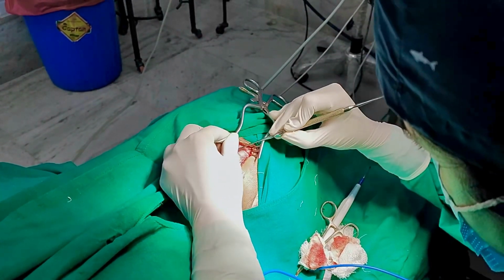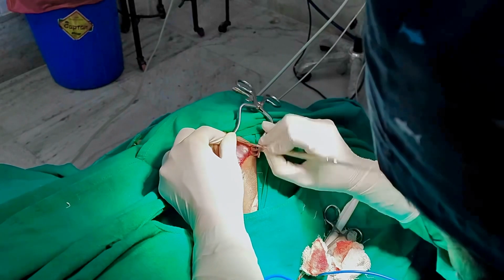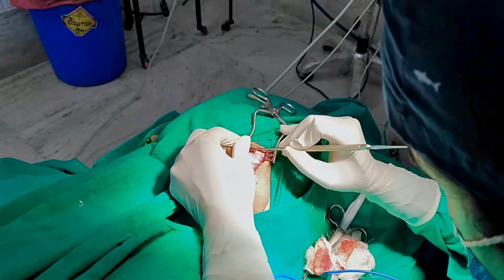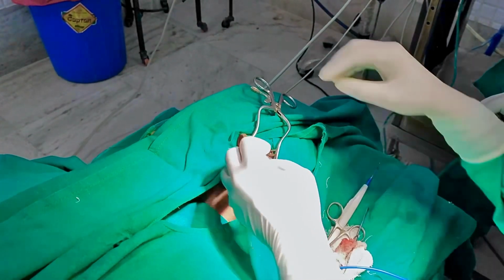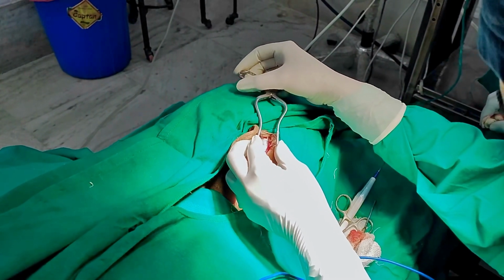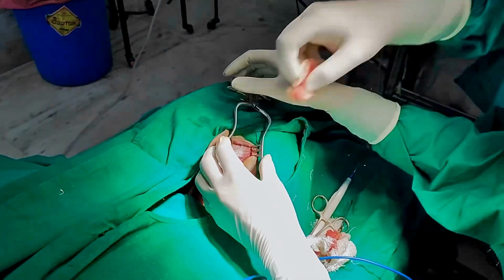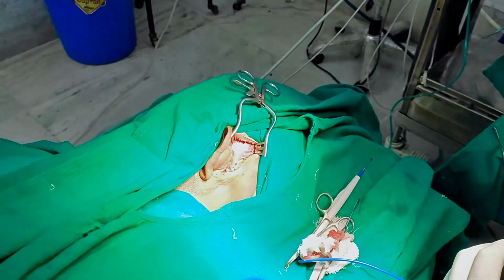So it is self-retaining, staying in place without the surgeon or the assistant having to hold the instrument. And it is hemostatic because, as you can see, it is creating a pressure on the edges of the incision, reducing the bleeding from the edges of the incision. So all in all, it is Mollison's self-retaining hemostatic mastoid retractor. Now as you can see, the temporalis fascia area has been exposed, and we are going to show you how the temporalis fascia is being collected.